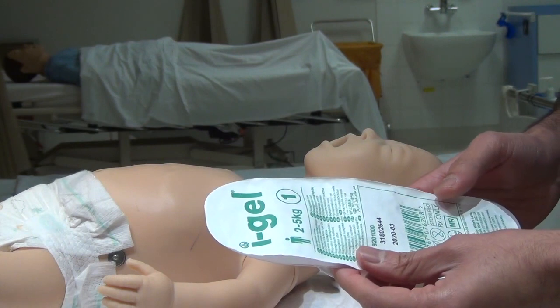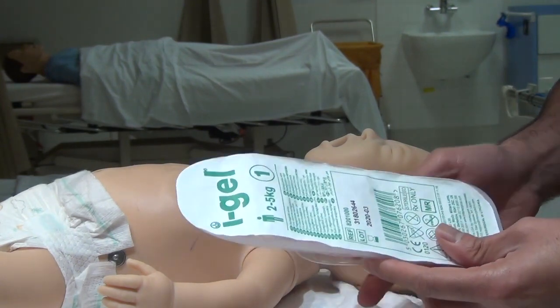We are going to demonstrate the use of iGel size 1, which is used in neonates weighing 2-5kg.